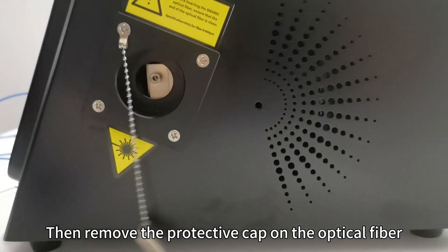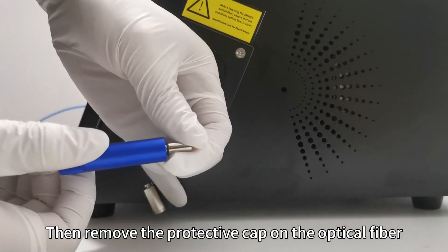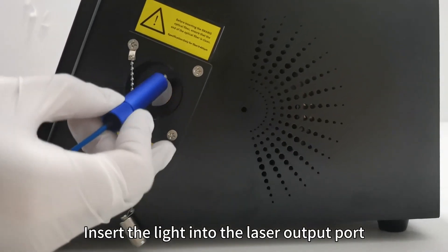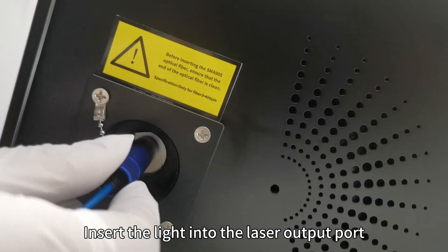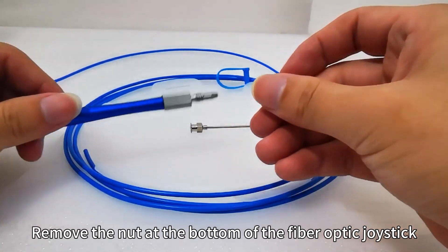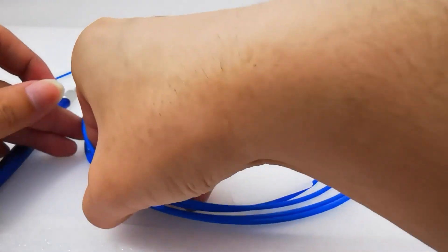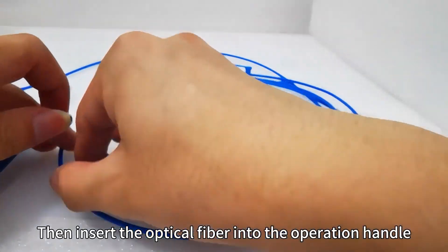Then remove the protective cap from the optical fiber. Insert the fiber into the laser output point, then remove the nut at the bottom of the upper optical connector, and insert the optical fiber into the operation handle.